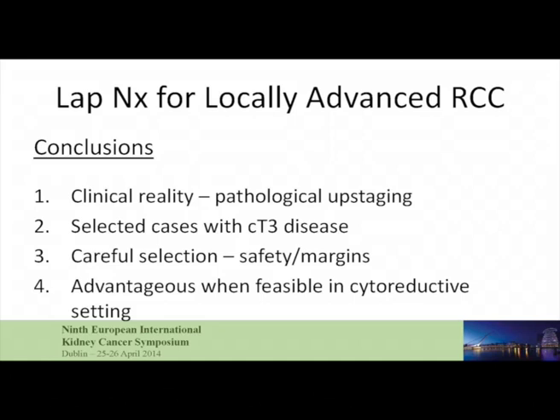I think it's advantageous when feasible, and again I stress feasibility and safety, in the cytoreductive setting, in that it will allow more rapid recovery and the reintroduction or induction of systemic therapy, depending on the clinical decision in terms of their longer term management.